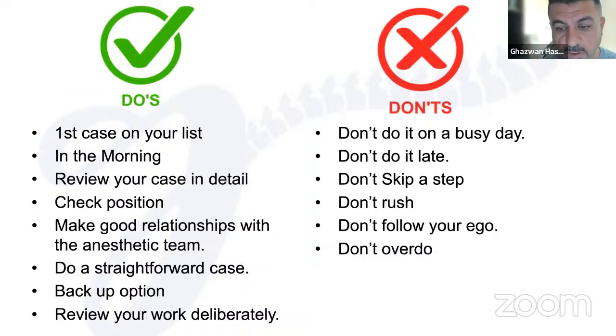And don't skip a step. In my initial cases, I skipped one lateral X-ray, and I found myself inside the canal directly, and I caused a dural tear at that time. Don't rush. Take your time, because the outcome is better than the time.